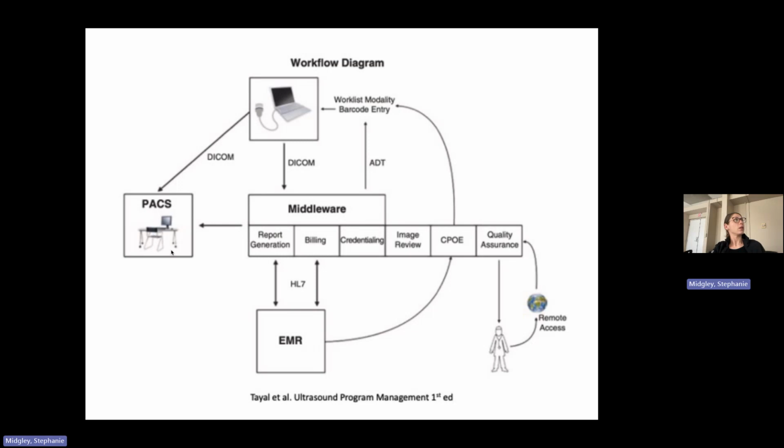The problem with this is that there's really not great communication between PACS and the EMR, which was our issue before we did our middleware. In order to view the images, you literally had to log into PACS outside of the patient's chart. You couldn't pull it in, so there was no connection.